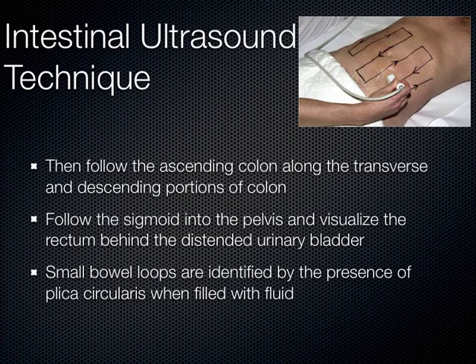When I'm doing a focused appendicitis exam, which I do quite often in the ER, I keep this mowing the lawn technique just around the right lower quadrant where the appendix is located, down there what we call McBurney's point. Or sometimes I just hand the transducer to the patient and I say, put this where the pain is. And then they start to push it on their abdominal wall, and they kind of help to localize where I should start my search for the etiology of their pain.